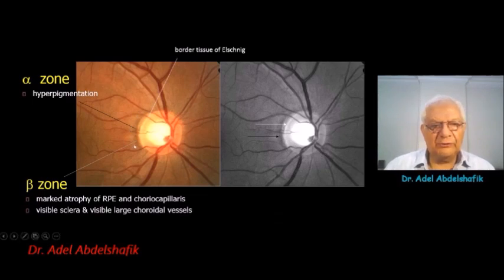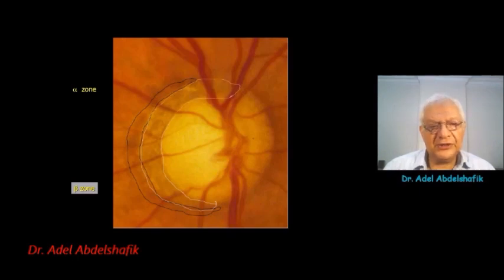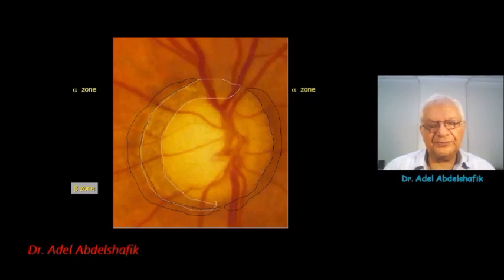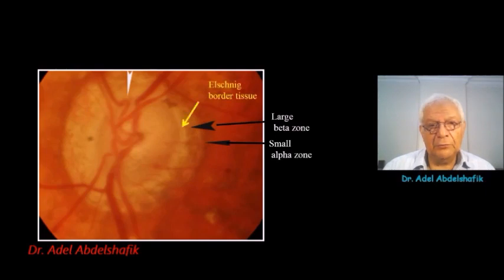Here you can see the zone of hyperpigmentation — this is alpha zone — then irregular pigmentation — this is beta zone. Just inside the peripapillary atrophy, this is the limit of the neural tissue. On this side, you can see only alpha zone. In this example: hyperpigmentation, irregular pigmentation, border tissue, then the disc will start from here.